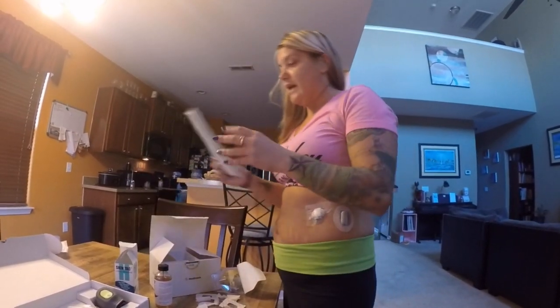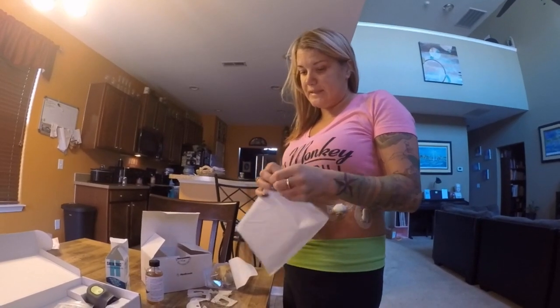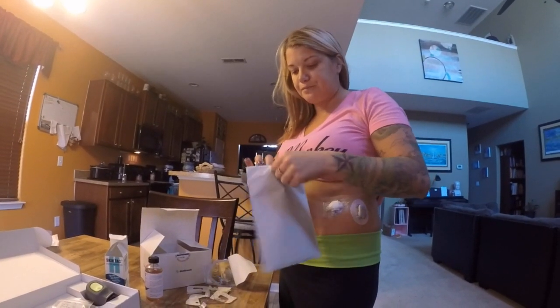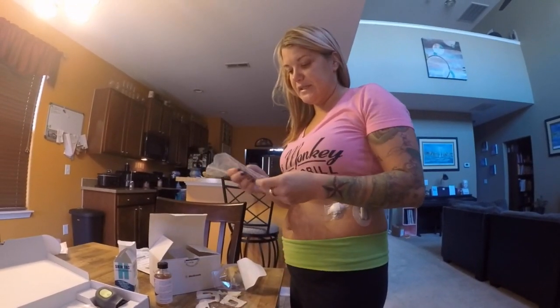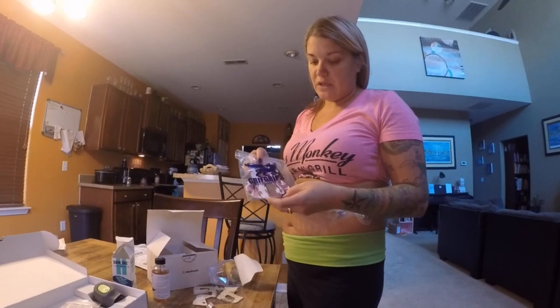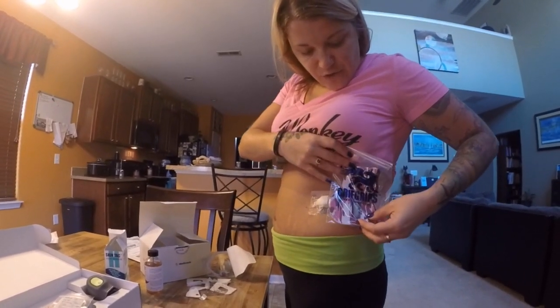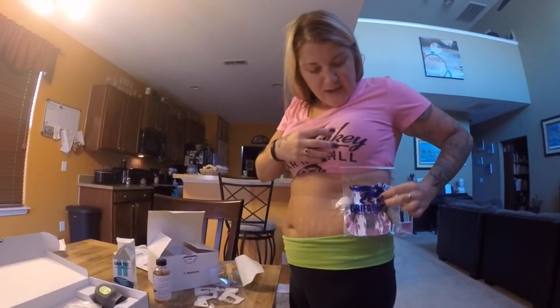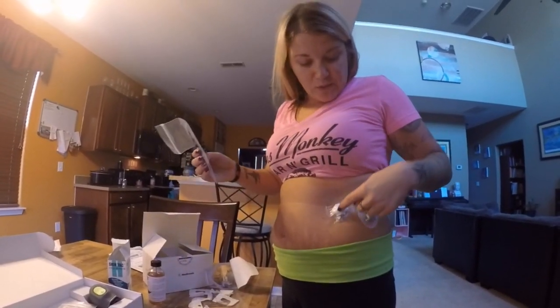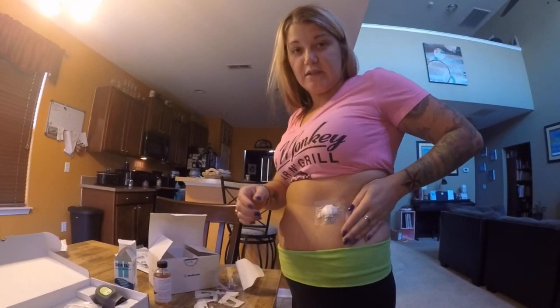When I wear the Dexcom on my arm I use these covers called GrifGrips — I'll put the website below. You get all different patterns and shapes. I got the cat ones for Halloween. They fit right over the sensor. Since this stomach placement will only last six or seven days, when it comes off I'll put the kitty cat cover on the next one, because that one's going to last a while.